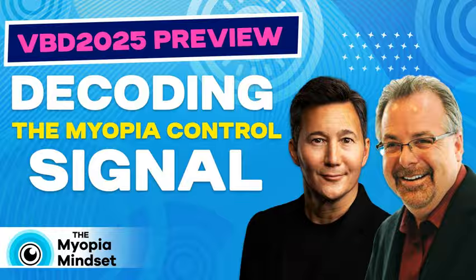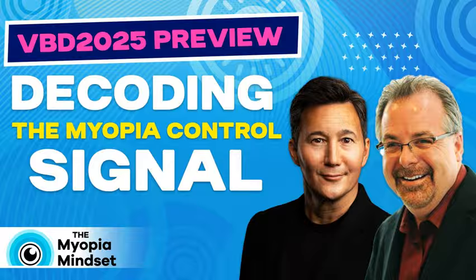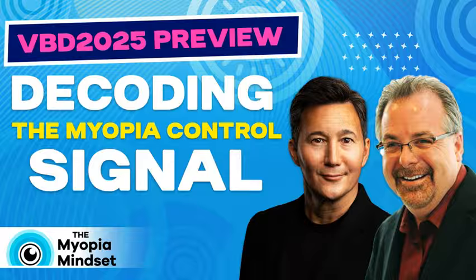The optical mechanisms of orthokeratology and multifocal soft lenses work on probably a very different principle than does atropine or pharmacologic interventions. So once we get that story figured out and we know how it works, we're going to be able to better target our treatments for these kids. But Randy brought up such a good point. 10 years ago, axial length measurements were just not even part of a normal practice. Today it is.